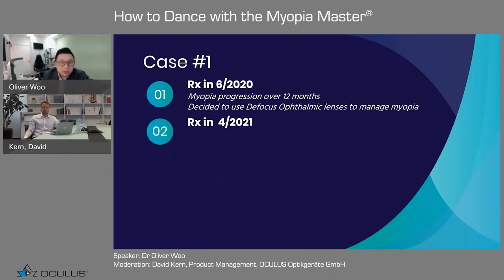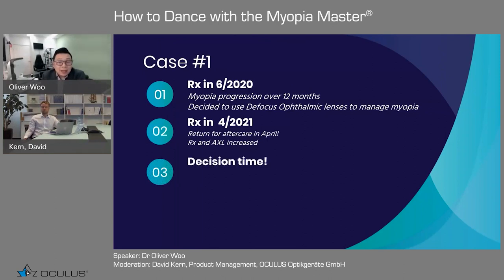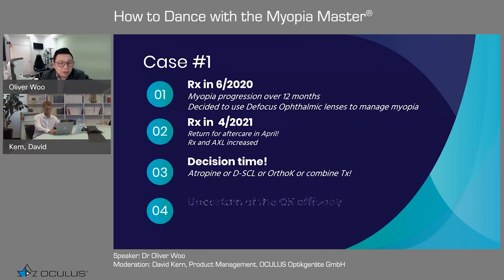So we have a regular checkup. He came back in April 2021. At the aftercare, we found there's axial length change and prescription change, and it made a decision time. The parents think about, should I use atropine? Should I use defocus soft contact lens now, or orthoK, or combined treatment? The parents are so uncertain about orthoK's efficacy, so they decide to give it a go, give it a try and see how it goes.